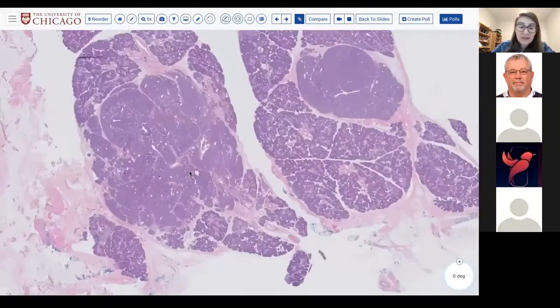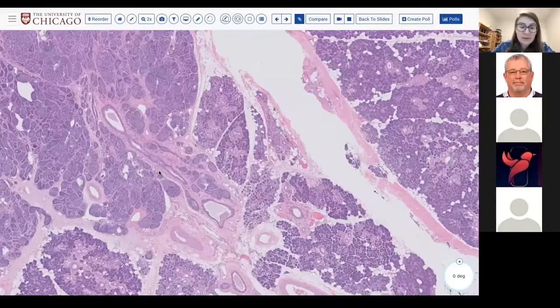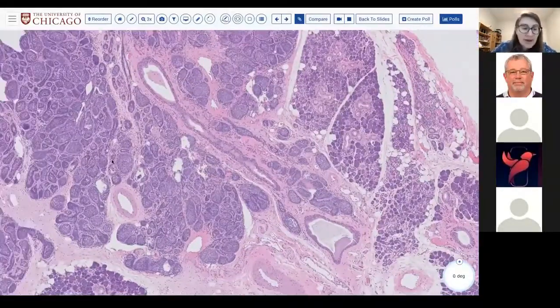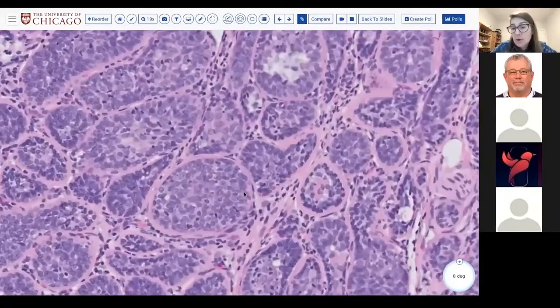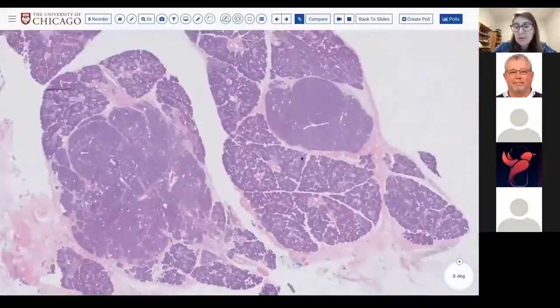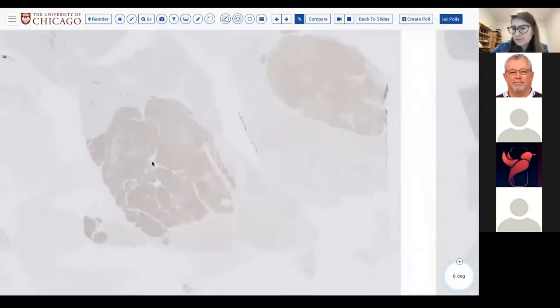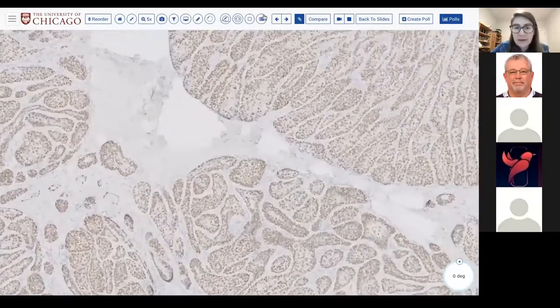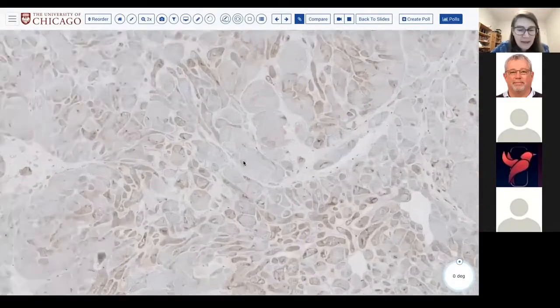And in fact, your permanent sections will concur with that diagnosis, where you have this infiltrative pattern along the duct, but you still have this tubulotrabecular and membranous architecture, again, with low-grade cytology. So this would still be a low-grade neoplasm, but a low-grade basal cell adenocarcinoma. And just to confirm with our panel of immunos, again, we have P40 to show that basal/myoepithelial cell component. We still have C-kit.